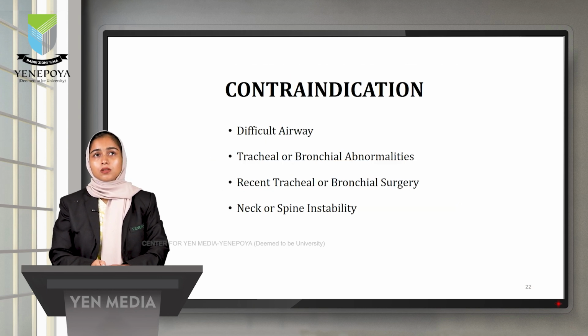Now we are moving to the contraindications. Difficult airway, tracheal or bronchial abnormalities, recent tracheal or bronchial surgery, neck or spine instability.